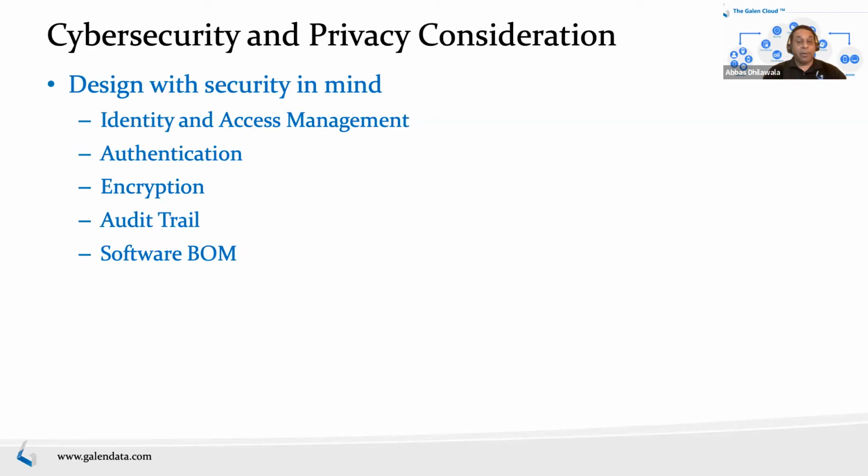You want to keep track and assess the vulnerabilities as it happens. And then enable secure design and coding practices, right, for software specifically. Secure coding is essentially a methodology that makes your developers think about security as they develop the code, and the same with the designers. That's a little bit of the cultural aspect. So you start thinking about security at every step along the way, and that's important.